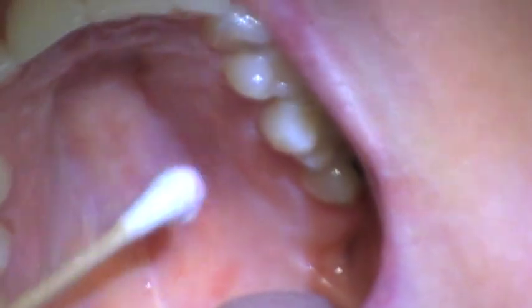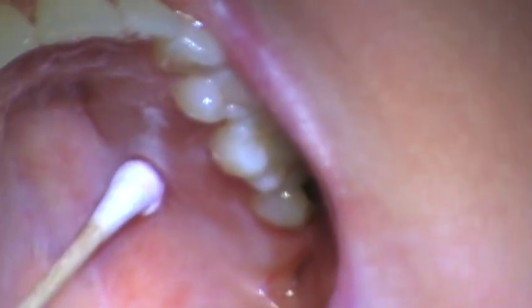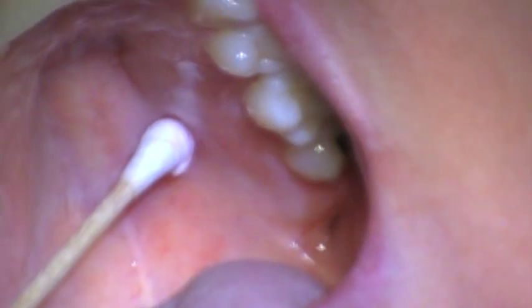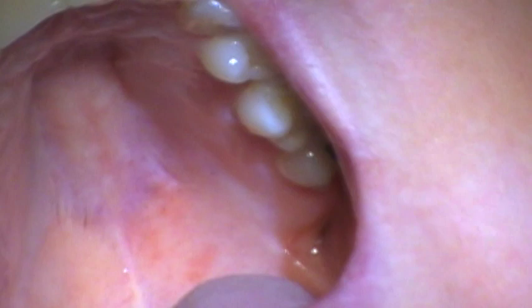It's usually around the second molar area, sometimes by the first molar, right where the planes of the vertical and the horizontal meet. Do you see how I'm holding the q-tip? You don't want to go in like this and then block your entry.